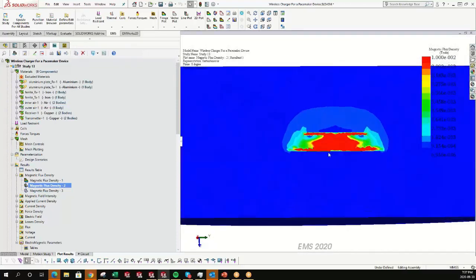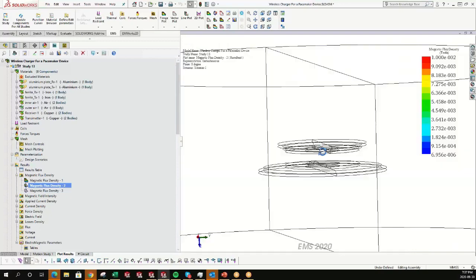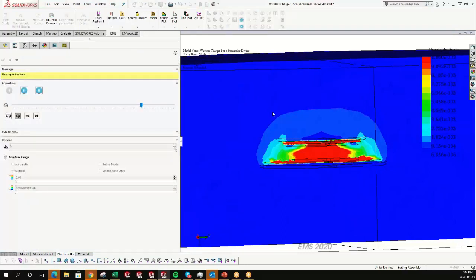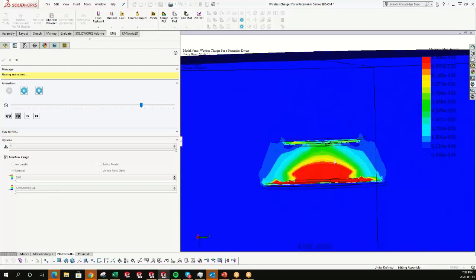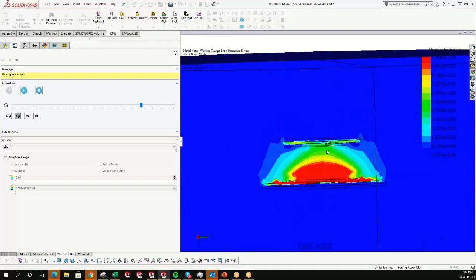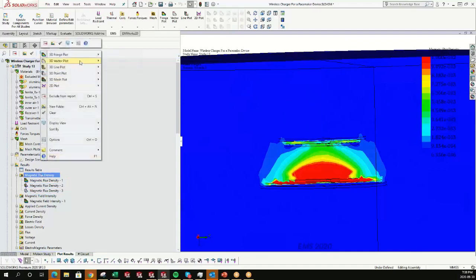Here we can see the magnetic flux that goes from the transmitter to the receiver. The transmitter is at the bottom and the top coil is the receiver. We can animate this plot versus phase or scenarios, or time if we are running time simulations. Now we will do the animation versus scenarios. It is clear that the magnetic flux becomes smaller when the distance between the 2 coils increases. As you can see, the red zone is just around the transmitter and doesn't reach the receiver coil. On the side, we can have vector plots also.